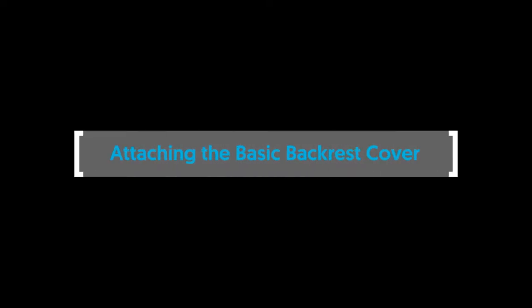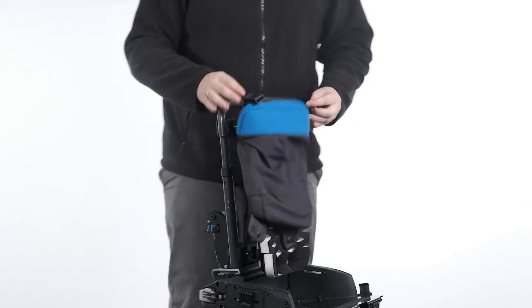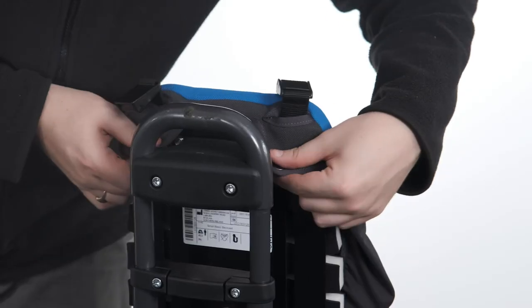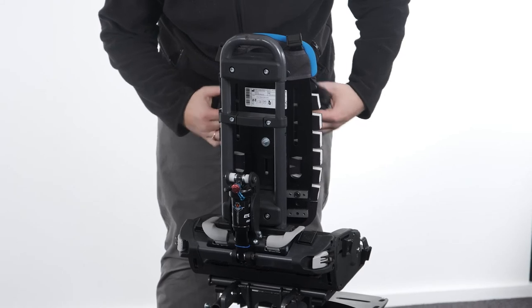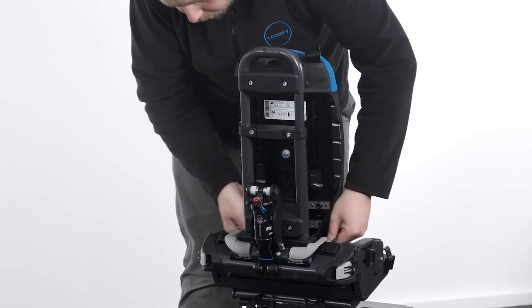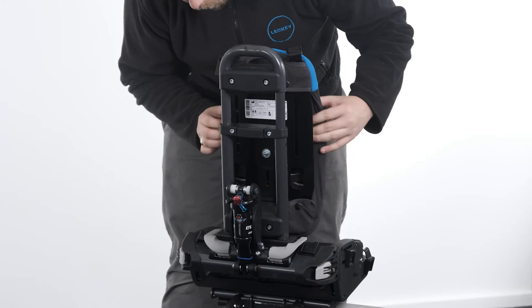Attaching the basic backrest cover. To attach the basic backrest cover, slide the top of the cover over the top of the backrest and secure in place with the snap fasteners. Slide the bottom of the cover underneath the bottom of the backrest and secure in place with the snap fasteners. Tuck the stretch fabric in between the foam and the platework along both sides of the backrest.